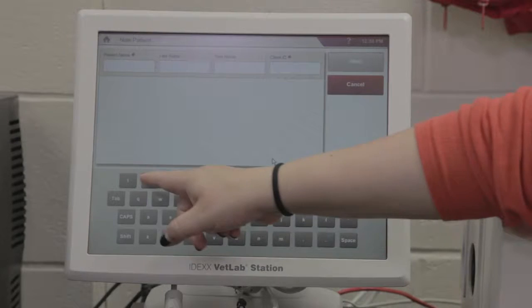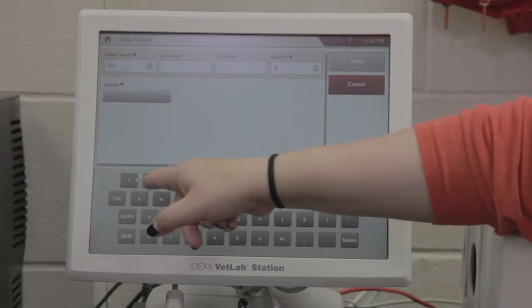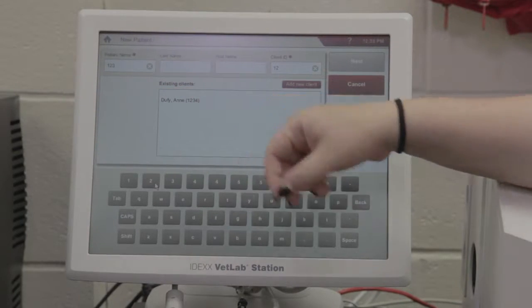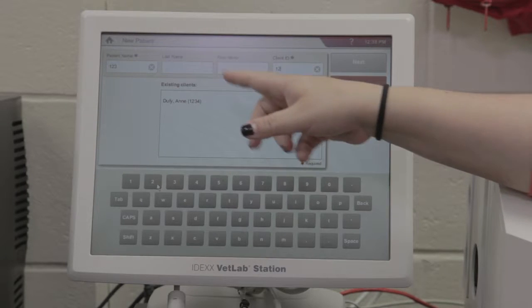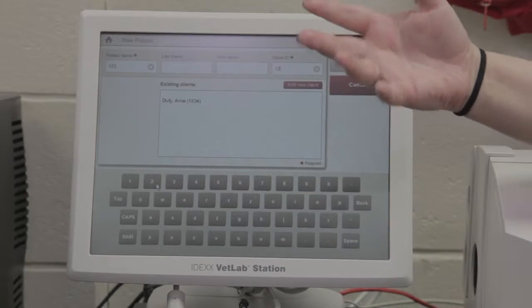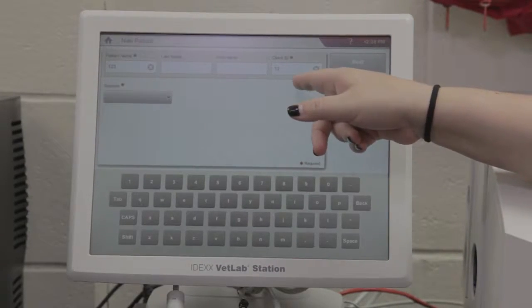So if we just enter a test one here, you notice that more information pops up. That appears to be Anne's information. So if it's a patient that you've run before, it will pop up with their information and you can choose them. Otherwise, if that's not the patient, you can add new client.